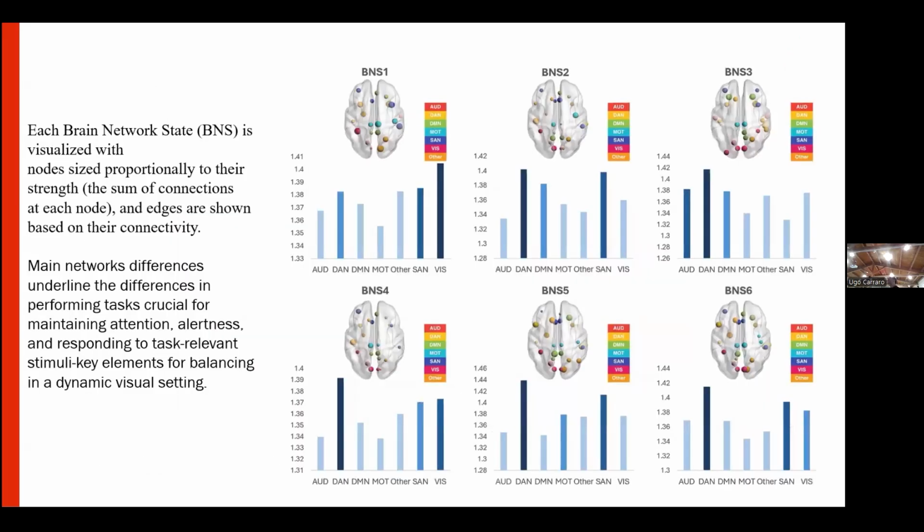But how can we visualize that and how is that related to the resting network state, so to what is happening in the different regions of the brain? Then you have to translate these results into a graph theory. So you have to design the different nodes and the different links between the areas. And then here you see the different weights of the resting state networks.